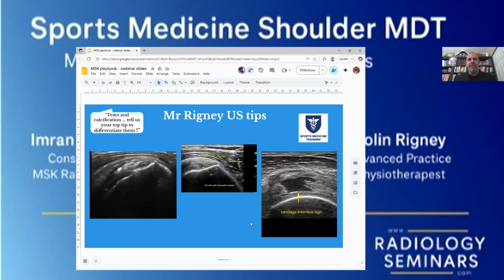just giving a solid overview of what the presentation may entail when you put the probe on somebody, because sometimes you don't know. And even when you do an uninvolved extremity comparison, sometimes you'll find that they might have something here and they're just asymptomatic, right? And so now it's up to you to help them. And then again, it gives you an education time to talk to them about, maybe your other side has some similar findings. Let's come up with a game plan to make your symptomatic side feel more like your other side, right? And so it's also a tool.